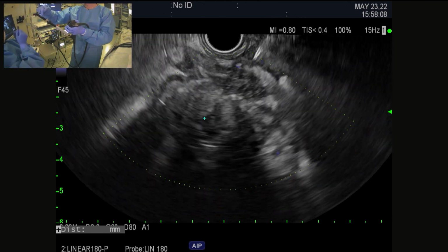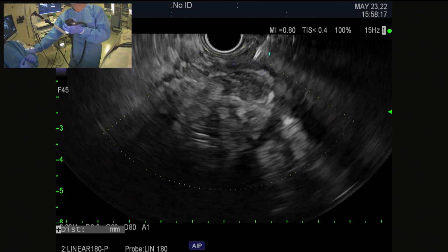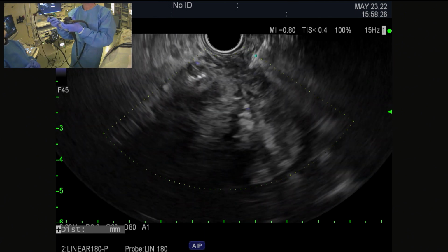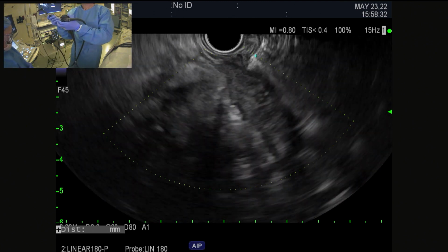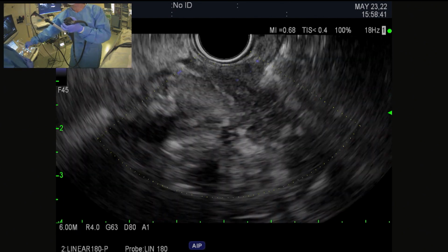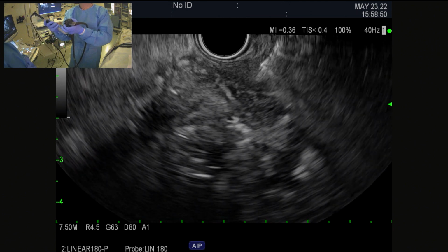All right, now you can see my nurse is making the device hot, so please connect it. You can see up here the bright echogenic sheath, right? And I'm just going to push up against the area I want to go. Right there, so you see it's tenting just a little bit. And I can swivel my body, again, to find the best location. You see I'm on Doppler, so it's always good to make sure that you're looking. You may want to magnify up a little bit and be really sure there's no vessel interposed where you're going. So I'm going to mag out, and now I'm going to take the Doppler off, and now I'm ready to go in.